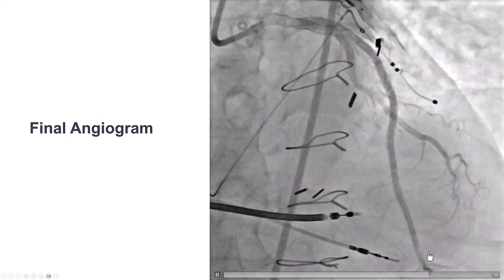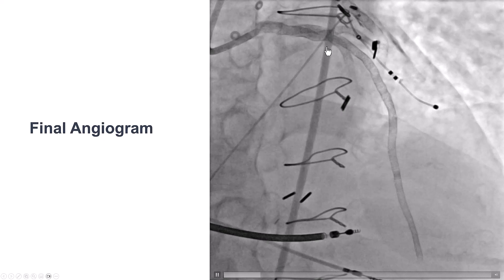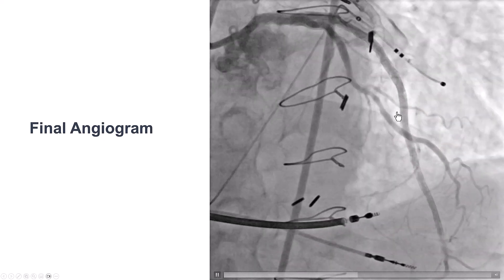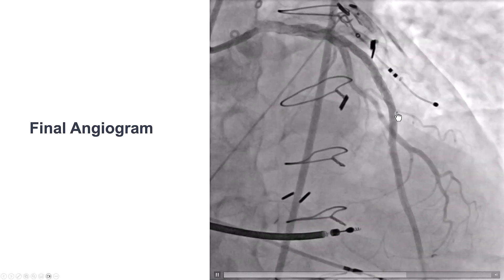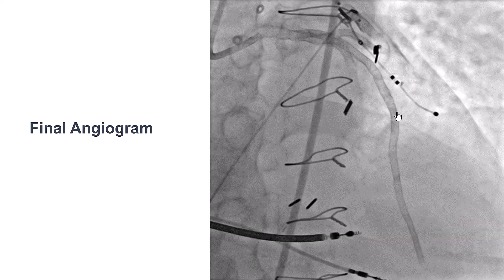And this provided a nice final result. We do have TIMI flow into the LAD. Again, extensive stent — there is still high risk of restenosis — but at least flow was restored.